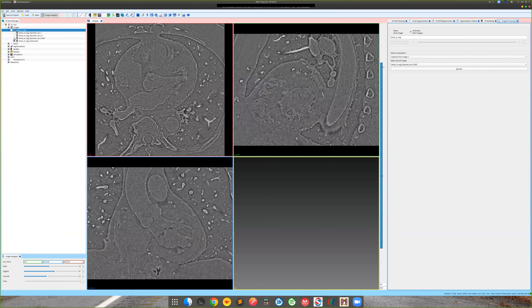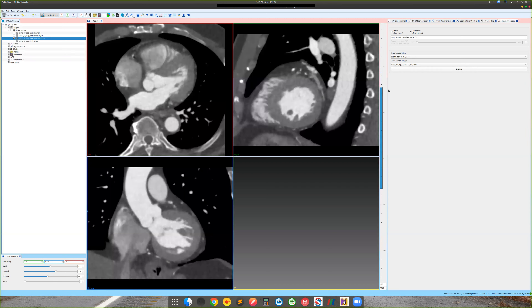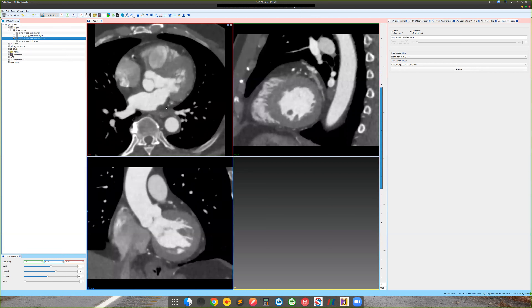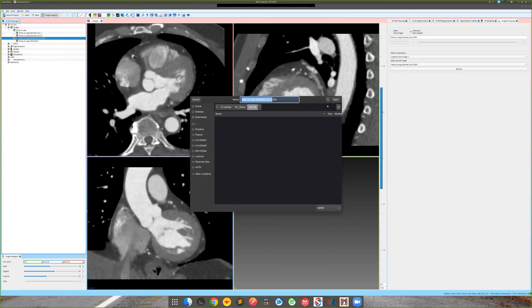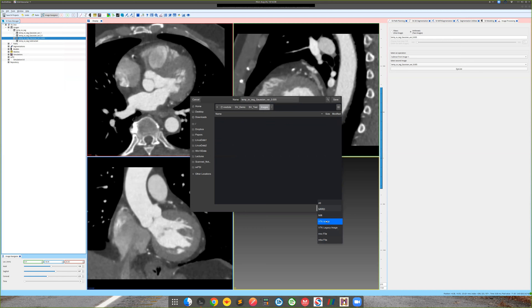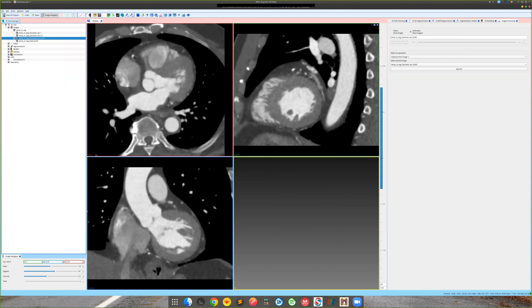Let's select the Gaussian filtered image with a variance of 0.005 as our baseline and work on 3D segmentation for this filtered image. Before that, we'll save this image to make sure we don't lose anything — go to sv_test, go into Images, and save it. By default it's in NRRD format, but you can select VTI format.